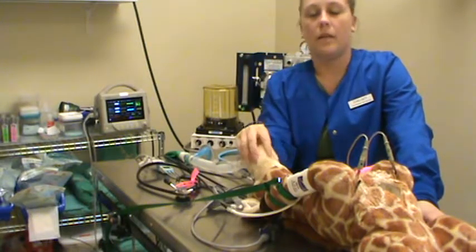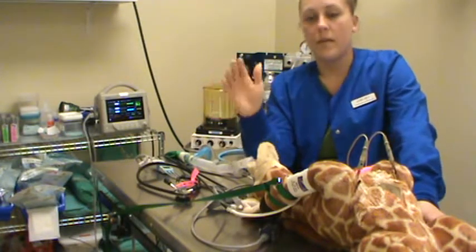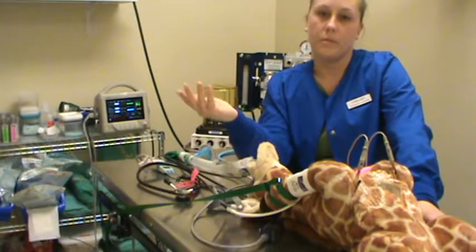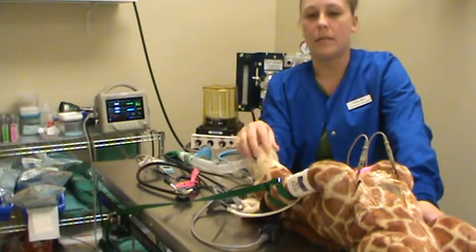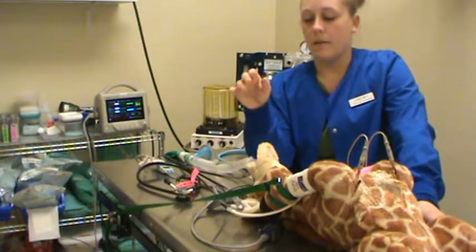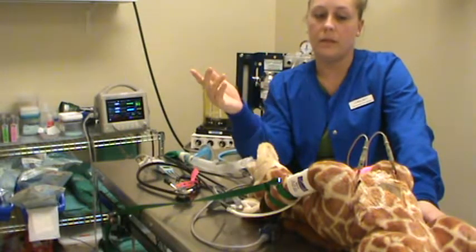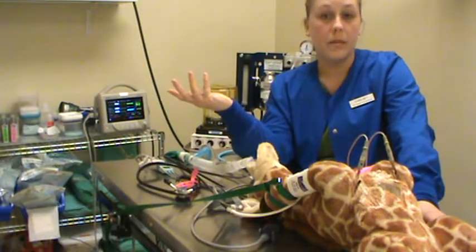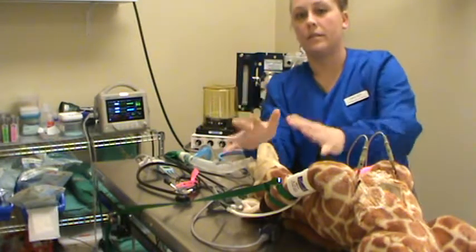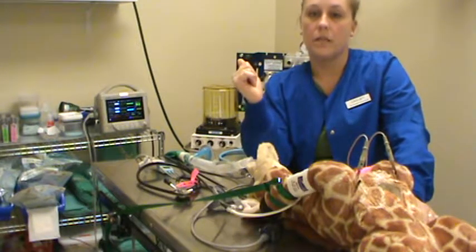A dog is going to be anywhere from 18 to 34, kind of depends, also 18 to 40. Again, if they're up on that 40 range, 35, 40, they're probably waking up, they're probably a little too light, so you need to turn up that machine and take a look at other vitals as well. So again, monitors can have failures, and sometimes the ECG leads in here will be giving me a heart rate and rhythm, and they're laying on the table. So you want to use your eyes and your ears as well as your hands, check out the patient, not just what the machine is telling you.